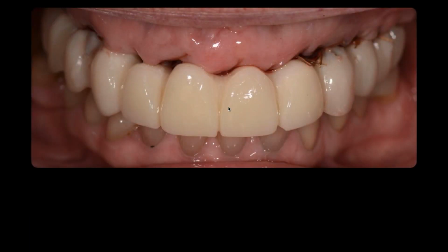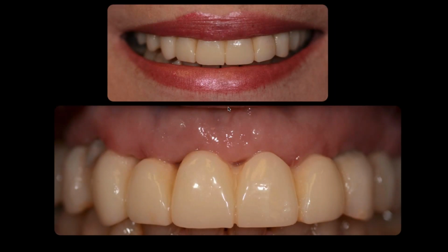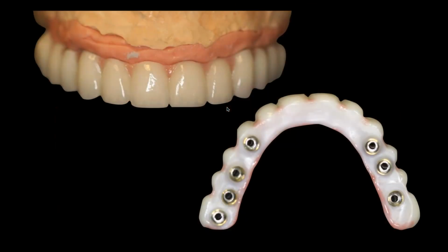Now the best thing about this is that we did the surgery, but you want to leave space between the gingiva. Leave the space. Don't put pink on it at this point. It's right after surgery. Let the gingiva come down, and it will. Two weeks later, look at her. She's looking great. And her lipstick is better, and the gingiva is contouring nice. This is going to work really well. Don't put pink on this. Don't put any pink. Do everything without pink, and make the teeth the right height. 10.5 millimeters height on the centrals for her.